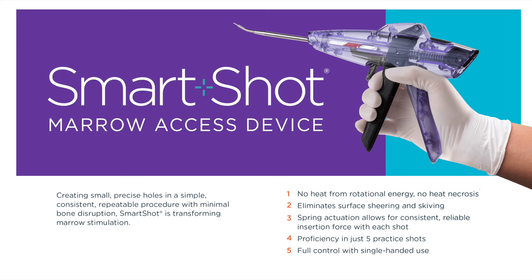The SmartShot Marrow Access Device allows for small, precise holes in a consistent, simple, and repeatable procedure with minimal bone disruption. SmartShot is transforming marrow stimulation.